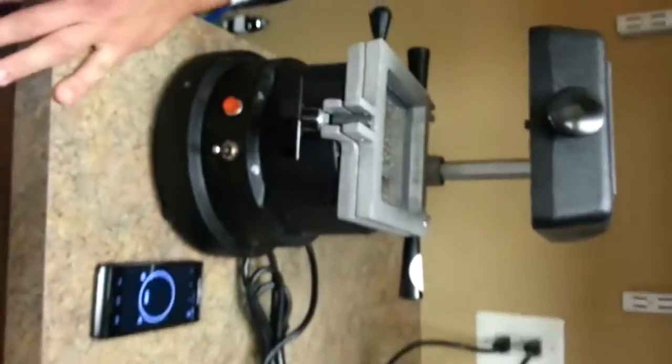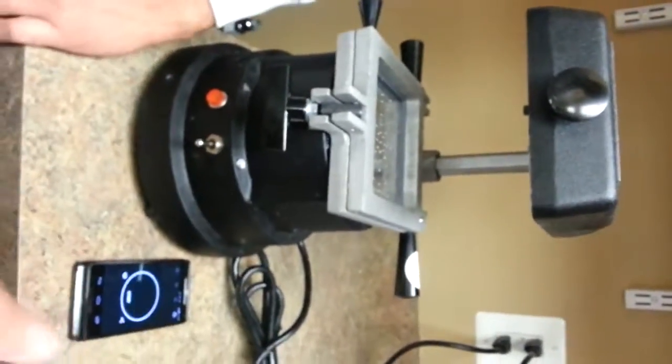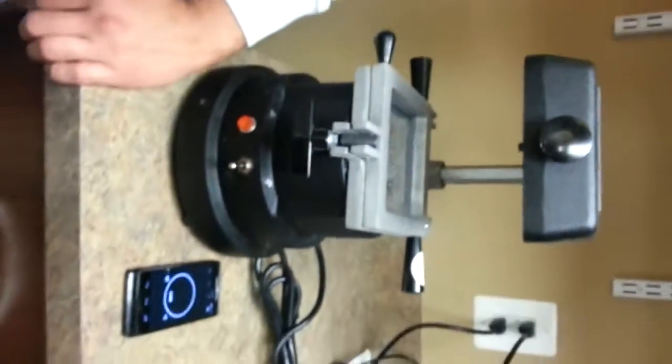the plastic needs to mold to the model. So we're going to put it in the fridge right here. Anywhere in the fridge is fine. Alright, and after that, we're going to take that out and I'm going to show you how to cut it. And that should be it for the whitening trays.